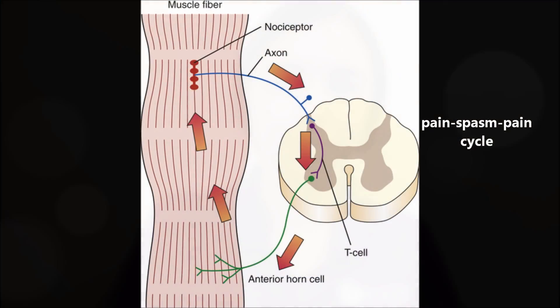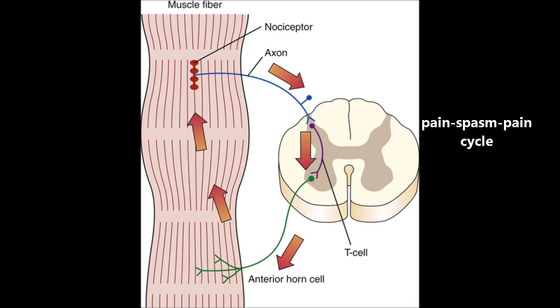I'll be using intermittent traction as part of his treatment plan. The benefit of using traction in this case is that it will promote relaxation of the paraspinal muscles by interrupting the pain-spasm-pain cycle. The changes in muscle tension during intermittent traction stimulate Golgi tendon organs to inhibit alpha-motor neuron firing, which allows for muscle relaxation.